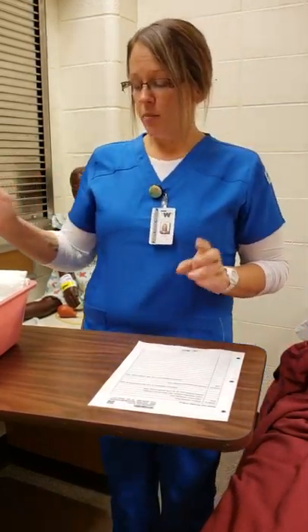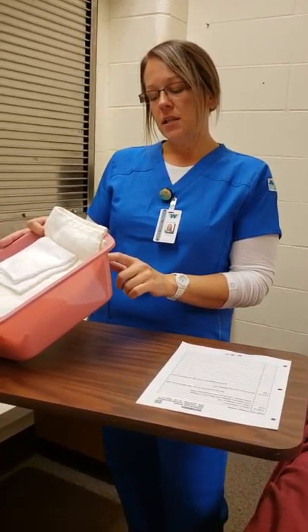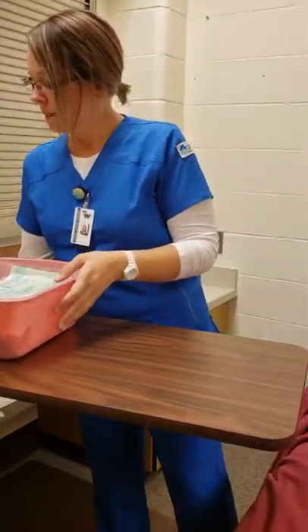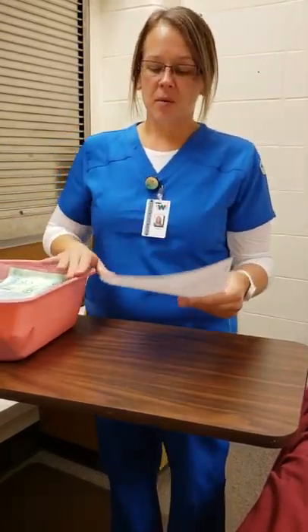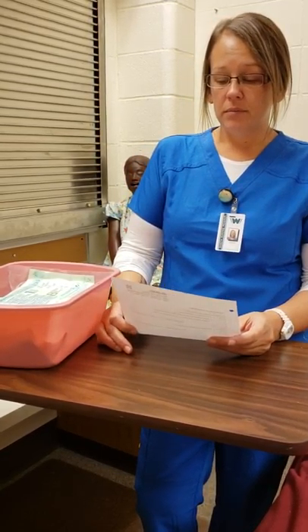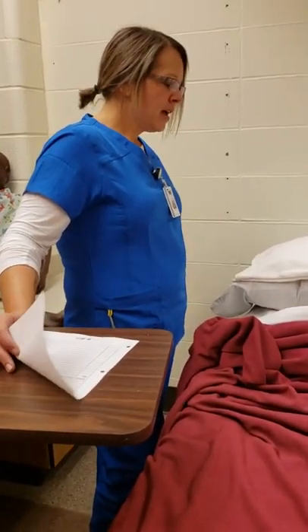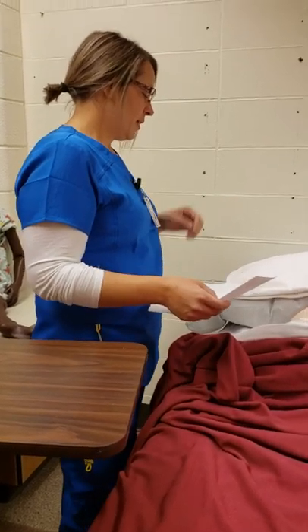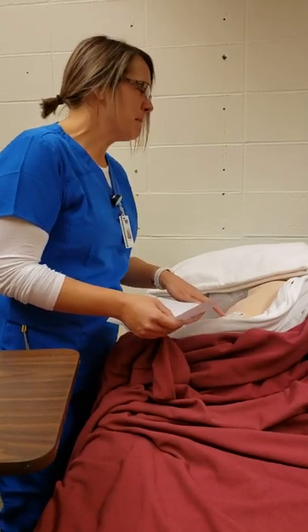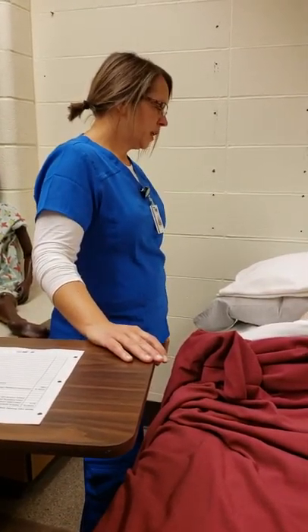First things first, I'm going to go gather my supplies. I have a bucket of supplies for Shirley Cole, 54-year-old female, date of birth 5-14-1964. Then I'm going to go into my patient's room, introduce myself: 'Hi Shirley, I'm Toni and I'll be your nurse today. Let me double check your name and date of birth — Shirley Cole, date of birth 5-14-1964.' Then: 'How are you feeling today? It looks like the doctor has ordered an indwelling catheter.'